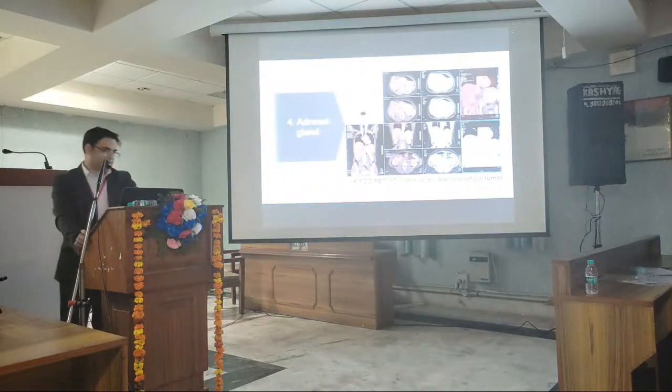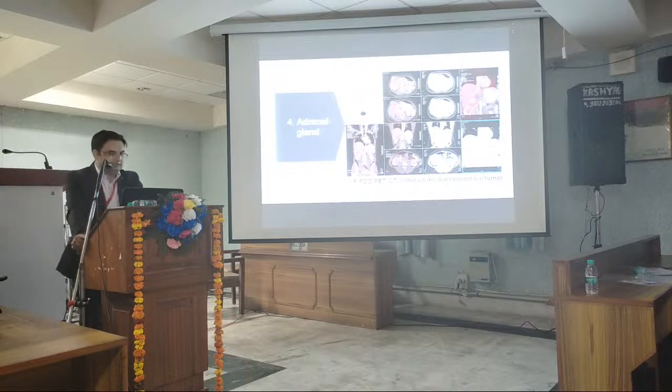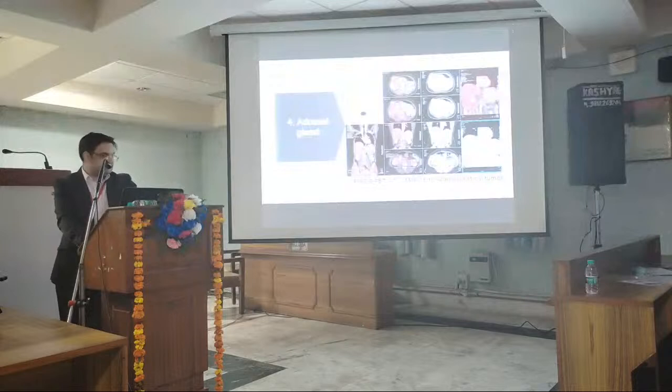Now from the pancreas I am moving to the endocrine glands. This is the workhorse of nuclear medicine, FDG PET-CT. This is basically used in the case of metastatic tumors, such as adrenocortical tumors. FDG PET-CT can help in initial staging, then response assessment and treatment monitoring. We have discussed this regularly in the morning also. So basically this is a metastatic adrenocortical tumor. This is the primary tumor and these are the metastatic sites.